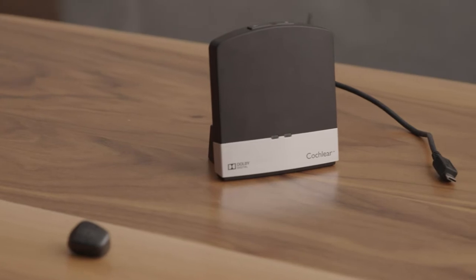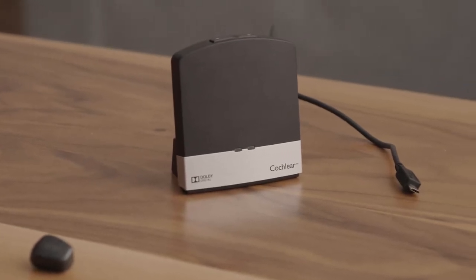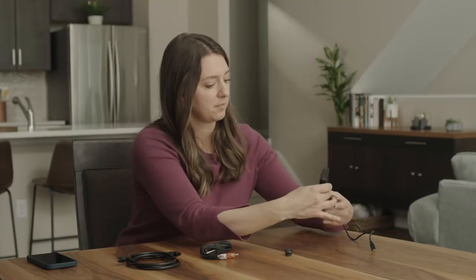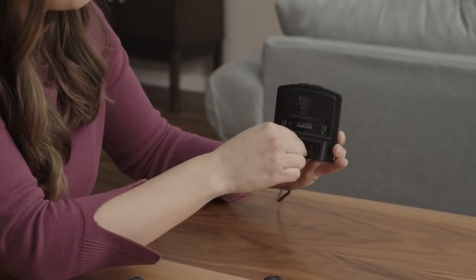The first step is to pair your TV streamer to your Baja 6 Max sound processor. First, you'll need to plug in the TV streamer to an outlet for power. Plug one end into the power outlet and the other end into the micro USB port on the back of your TV streamer.